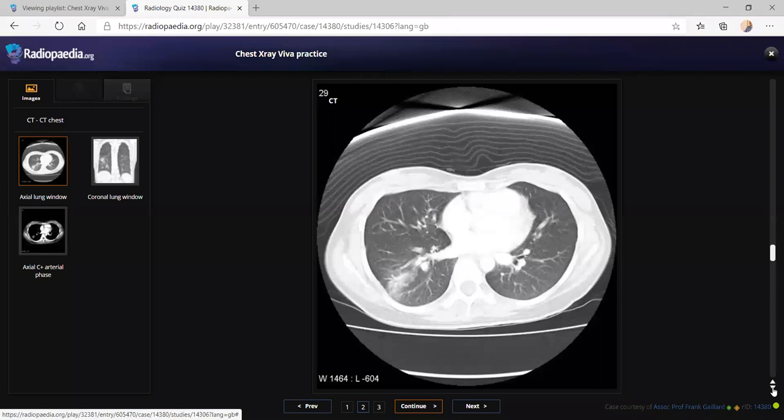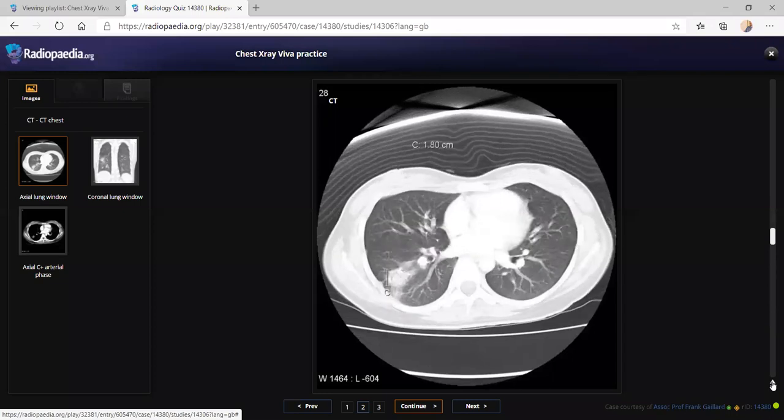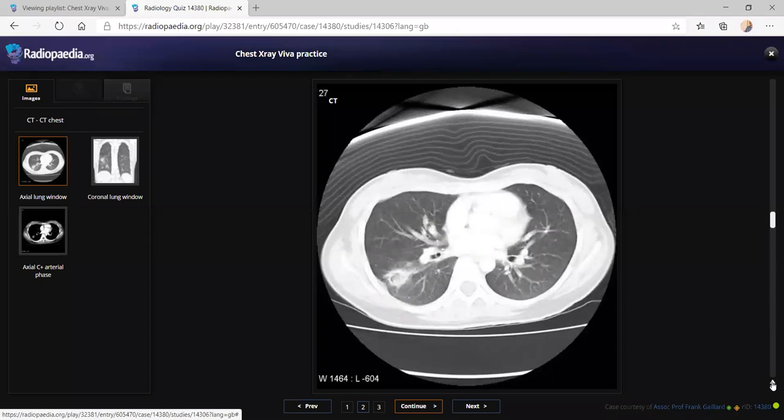Okay. So if this patient is immunocompromised or has any other debilitating condition... This patient is immunocompromised. Okay. So this would make my first differential a case of aspergilloma, and my second differential would still be a metastatic process from an unknown primary. So I will convey my findings.